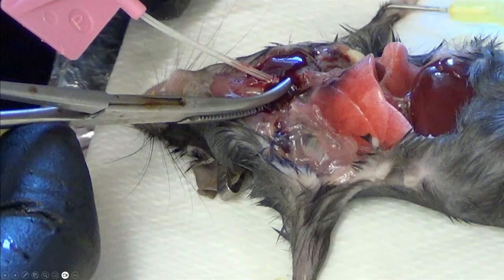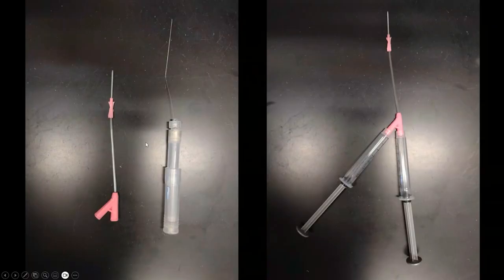So what we do is we will take a catheter. We get these from Becton Dickinson. Oh, here we are. This is an example of the catheter. I removed this component here. It has a needle inside. So you pull this. It's attached and connected into this catheter. You remove all these components, and pull out the needle. So you just have this part, and then attach the syringes, which you'll pour the agar into to inject into the mouse.